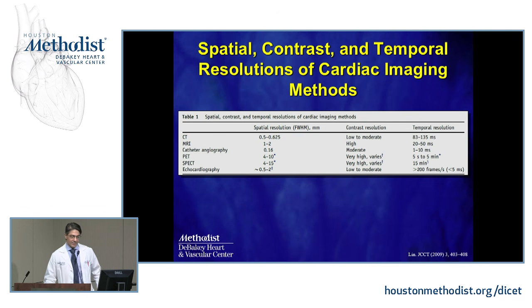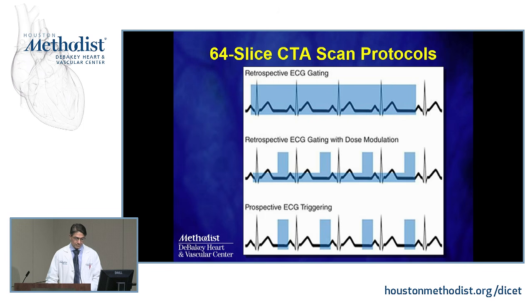And then this is just a different summary slide going over the different types of resolutions of different imaging techniques. For spatial resolution, Dr. Shah, remember this, CT is king. For contrast resolution, MRI is very high, but believe it or not, SPECT and PET are higher. And then for temporal resolution, nothing beats echo. So some simple take-home points y'all already know.